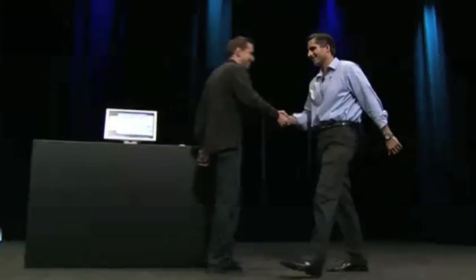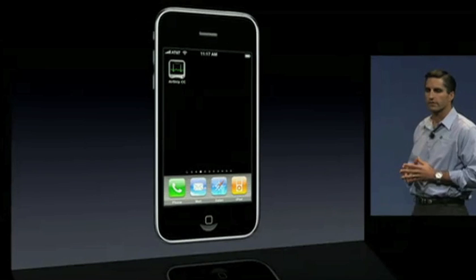Thanks, Scott. Good morning. Driving today is Airstrip co-founder and CTO Trey Moore. You know, at Airstrip Technologies, we are all about patient safety. Now, you're familiar with Airstrip OB from the video earlier. That application is already FDA cleared and is approaching 100 hospital installations.